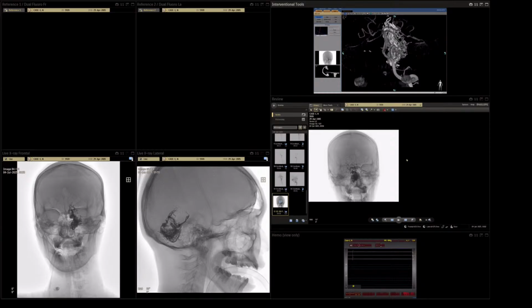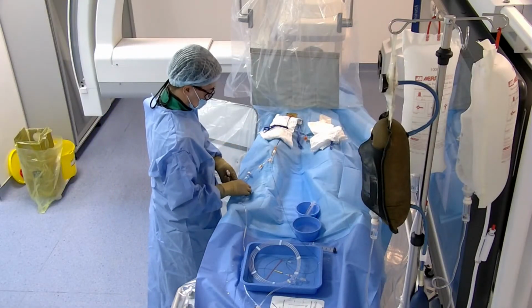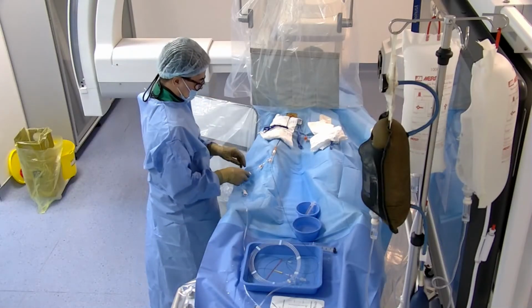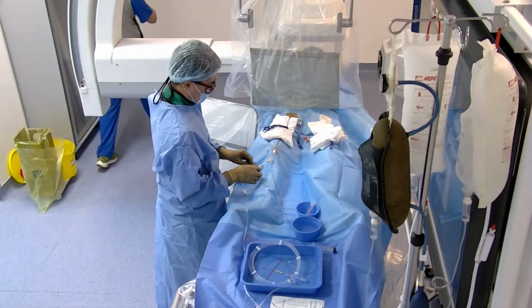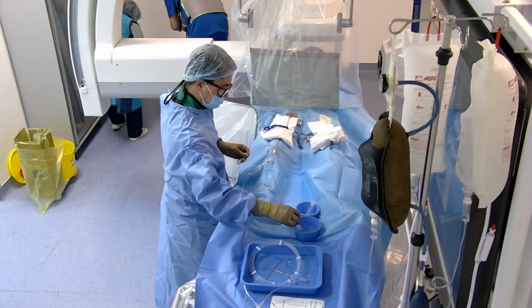Nowadays we have Sonic only, and we need to order the hybrid extra, but unfortunately we have a limited number of hybrids. We have only one hybrid.